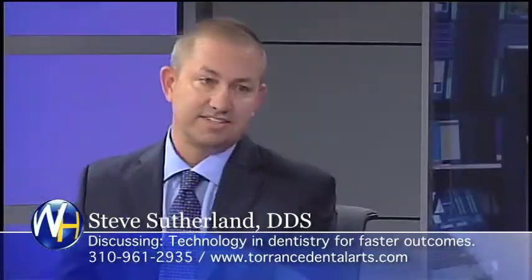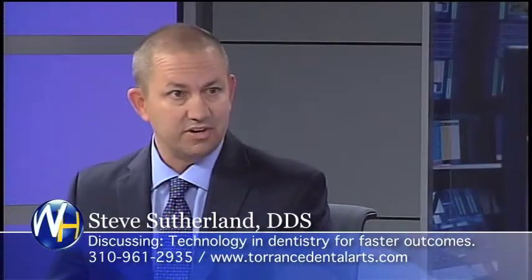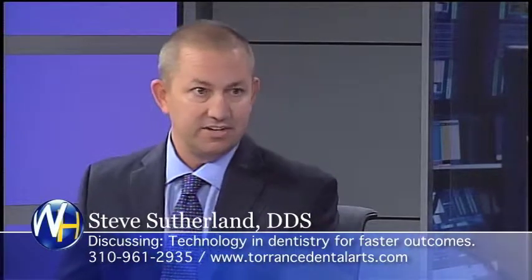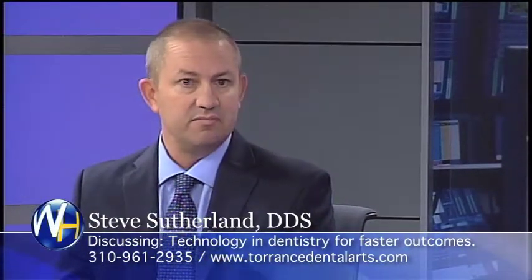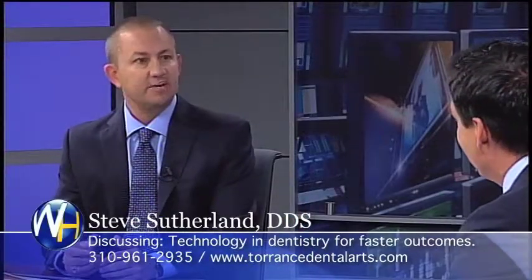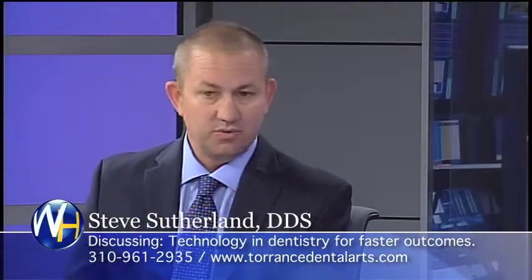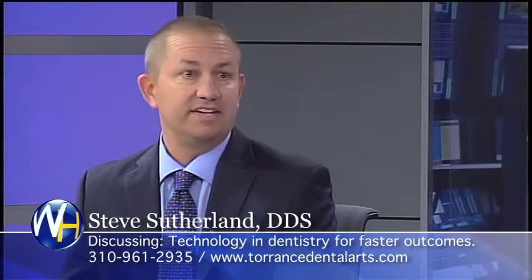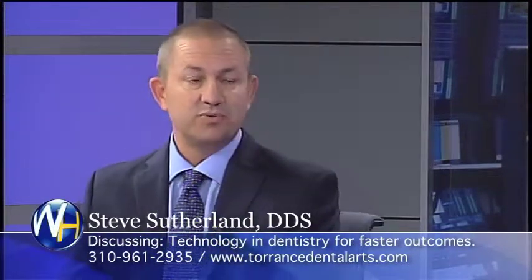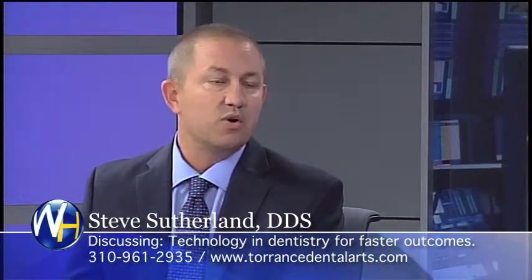Do you have your own lab? Yes, we have our own lab. And most of the dentistry has gone in this digital direction where a lot of it's made without a lab technician on a CAD/CAM computer where we can make the crowns right here in one day. Now, I haven't seen this firsthand, but in your office, it's like a wand that goes in their mouth. Yeah, we actually have a computer, and on that computer is a camera. So after we get the tooth ready to go, we take a picture of that tooth. We then design the crown right in front of the patient as they're sitting there watching. And once we have it done where it fits into the mouth, we send it to a milling machine. It mills a crown out of a tooth-colored block.